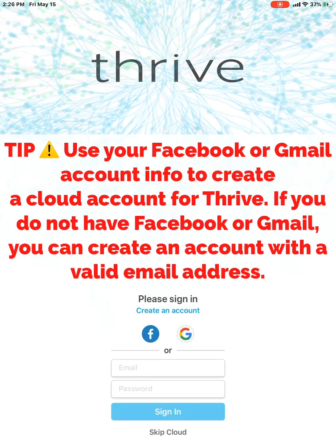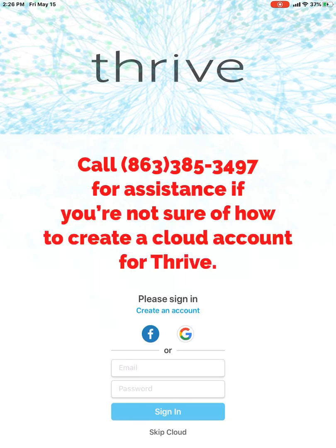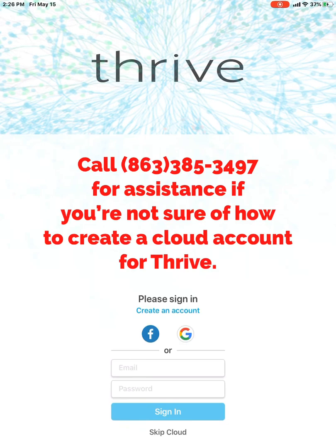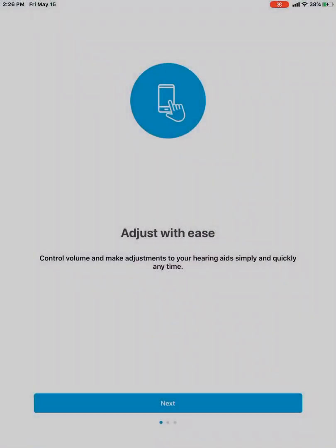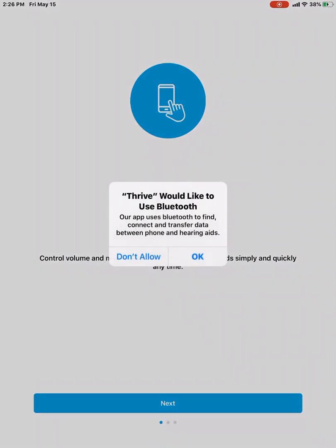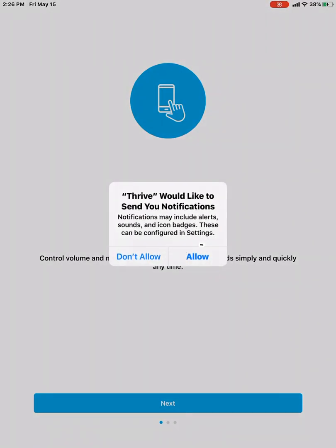You can contact your hearing healthcare professional if you have any questions about how to enter your own email address and your password, how to create an account for that cloud if you have any questions about that part. So I'm just going to skip past it for now. And then it will ask me whether I want to use my Bluetooth and I'll hit OK because Bluetooth is how we'll connect with the hearing aids.